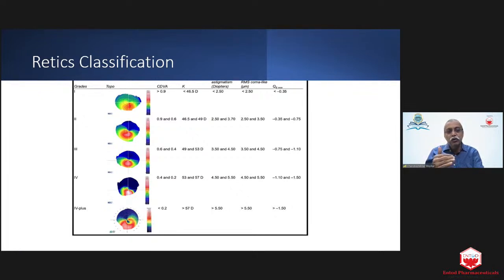When you go to keratoconus beyond grade 3, everything is so vulnerable and unpredictable that if the patient wants, the best thing is to do some regularization procedure like topo-guided PRK or Intacs, depending upon the K value, and get the cone central or regular, and if possible both, and then think what to do.